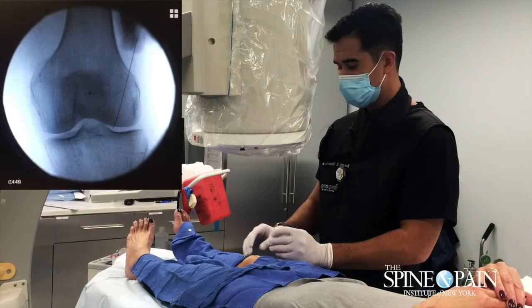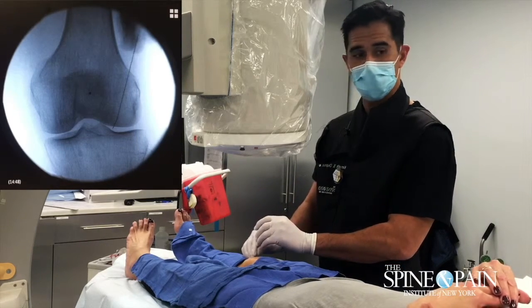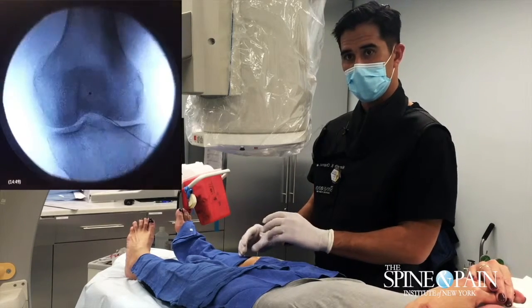You can see she has pretty good diffuse narrowing, so we're going to enter on the lateral aspect of her left knee here, a little pinched here. All right, and we're going to use this needle. We're trying to get it into that space.